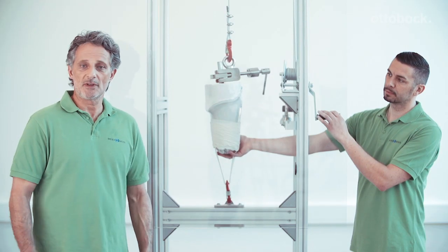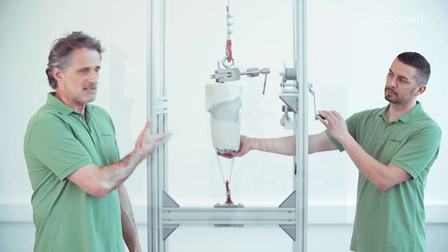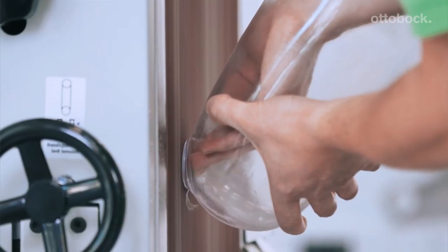The socket is now removed from the plaster model. Neither the model nor the socket should be damaged in the process. After we have removed the screw from the dummy, we use a winch as an accessory. Then we come to the grinding.